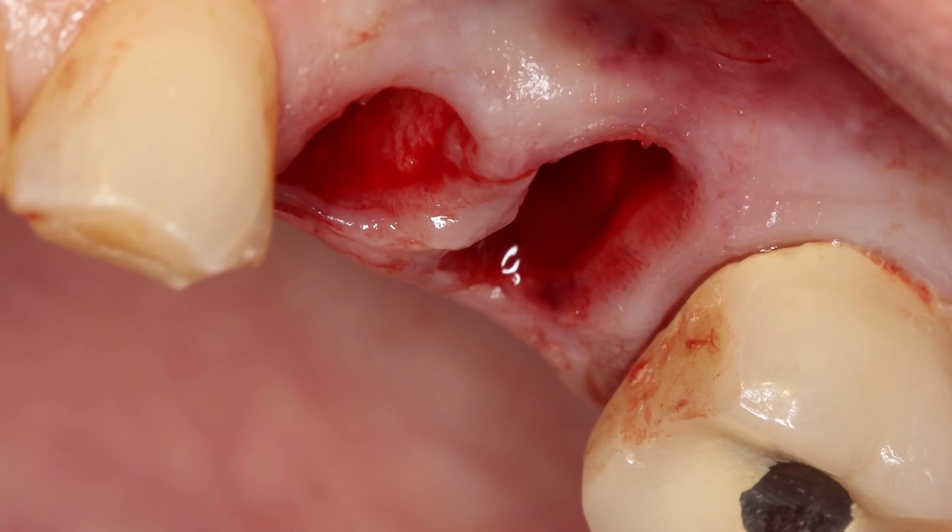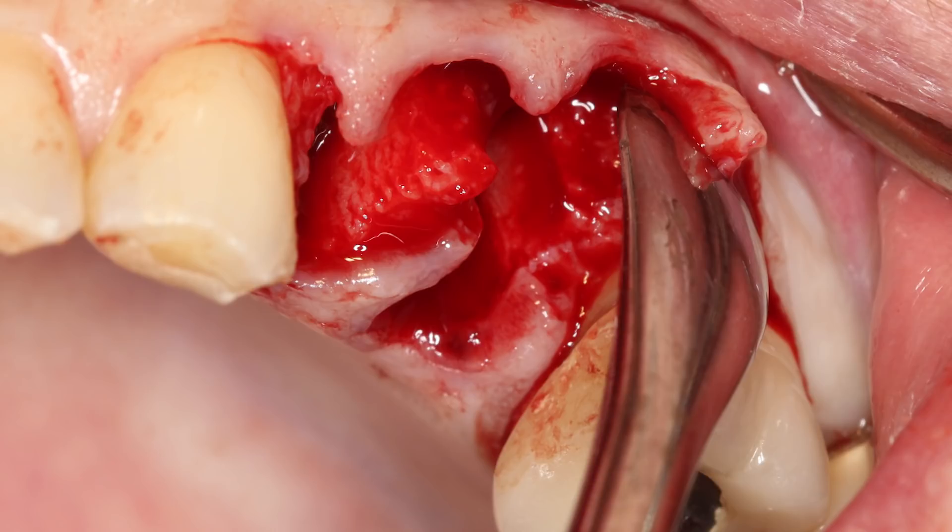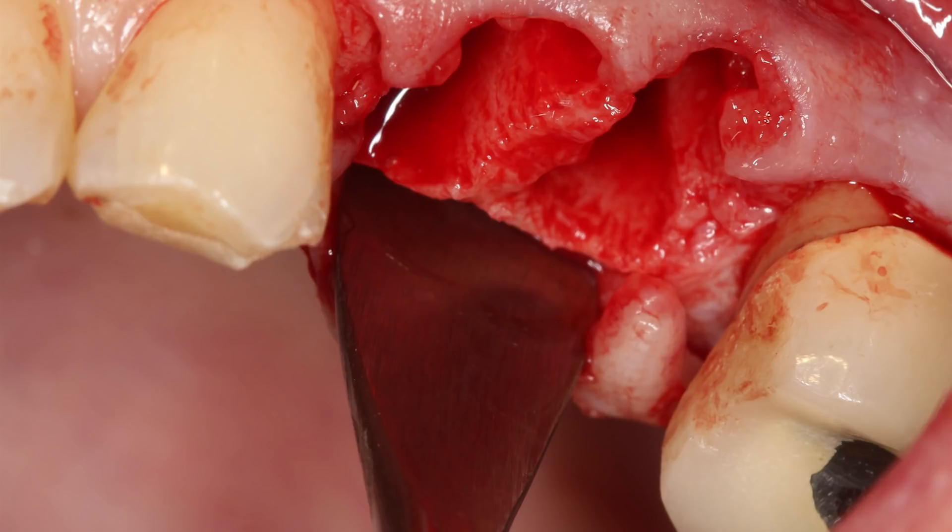However, after more extensive evaluation, it was apparent that there were facial defects on the walls of the socket sites caused by the root fracture and subsequent bone loss. An orband knife was used to create a controlled incision and an envelope flap was created. A periosteal elevator was used to move the attached gingiva facially, exposing the bony defects, and the palatal attached gingiva was also relieved. This was an important step to help maintain a passive position for subsequent placement of the protective membrane.